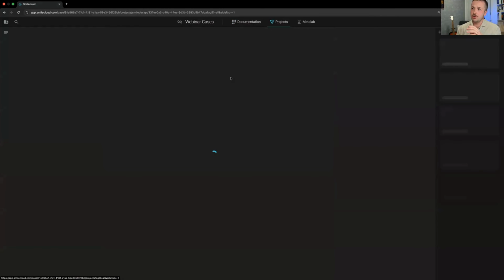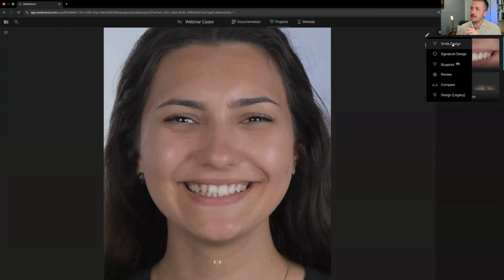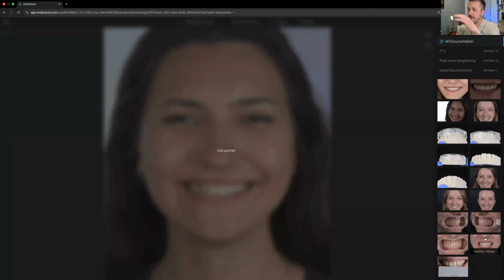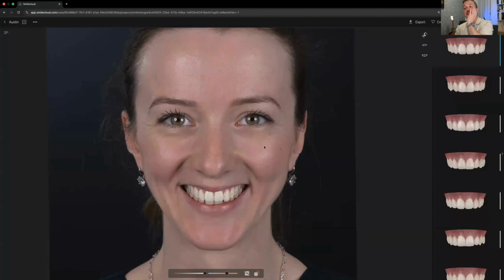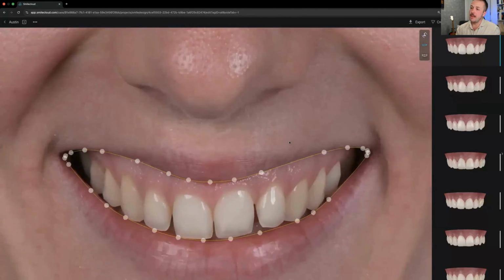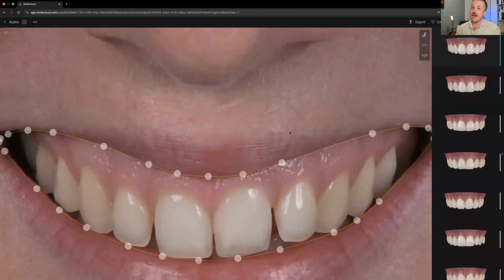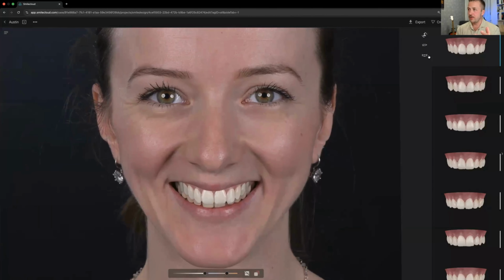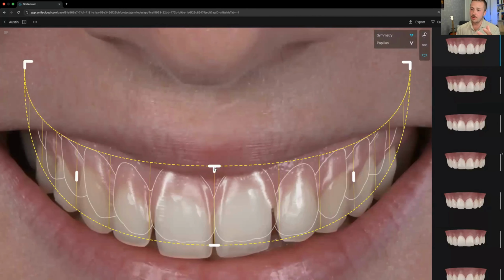In the other case I want to show you, we usually have, let's say in 90% of the cases, an uneven gum level, tissue positioning, zeniths. And in these cases, it's sometimes not so easy to have a fast way of dealing with things. So that's why we usually don't have a streamlined process.